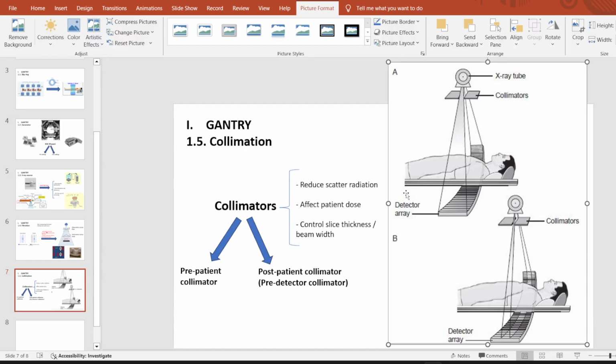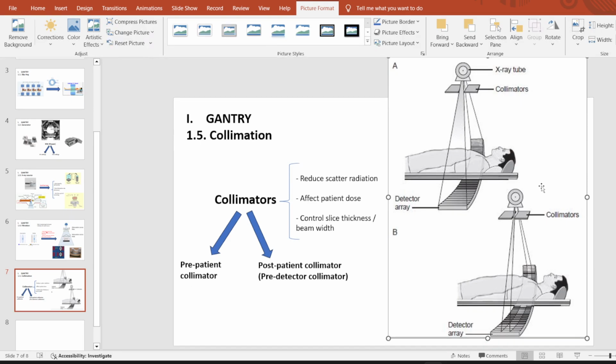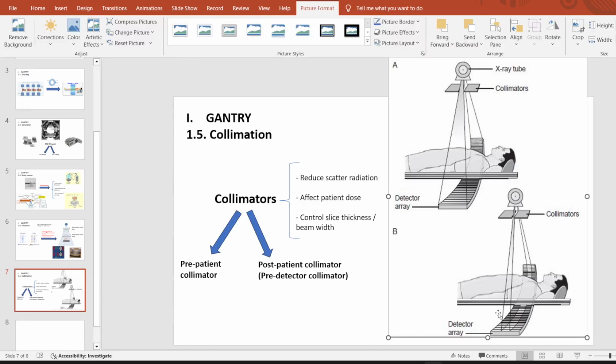So as you can see here, the detector right here is normal. Nothing changes when you use a single detector, just like a conventional CT in the 20th century. But the point is, our modern CT models have a multi-detector array. So right here, it's the Z axis. We have talked about it once, right? If you change the gap between the collimators right here, you will change the way the beam behaves. What does it mean? It's simple. You can pick which rows of the detector array could be used. Just like that, my friend.